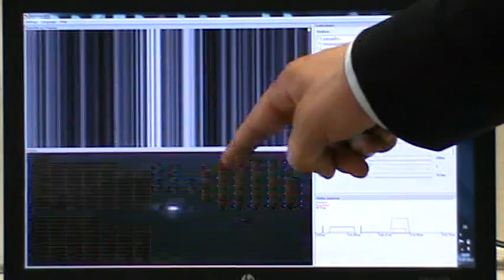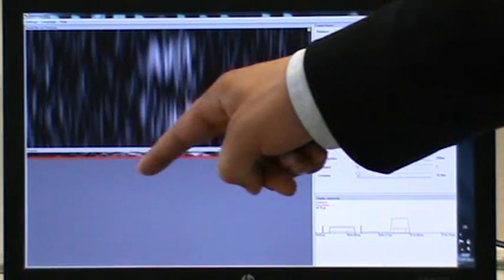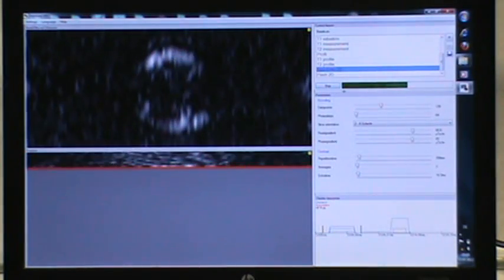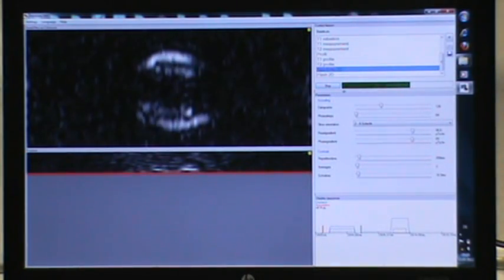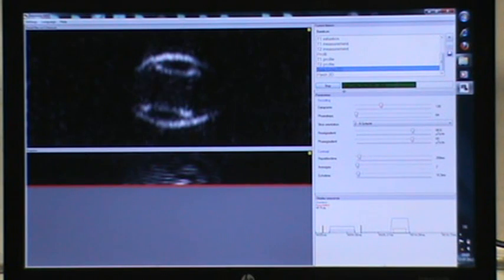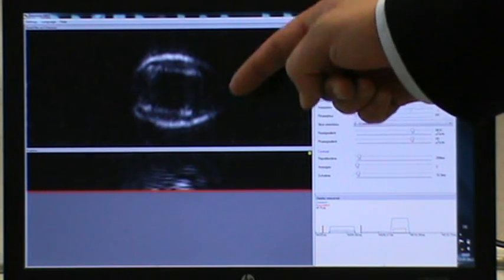Line by line, the encoded data is written into a matrix and the recorded signals fill the location and frequency domain.